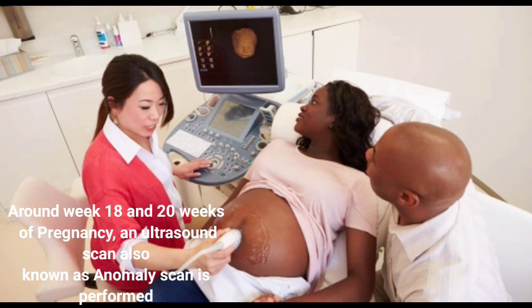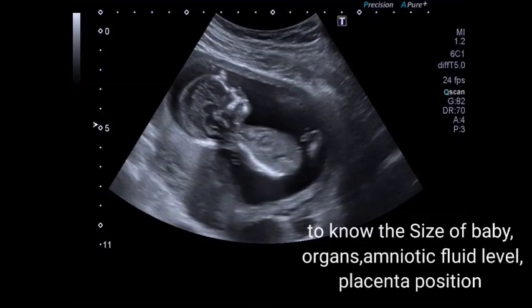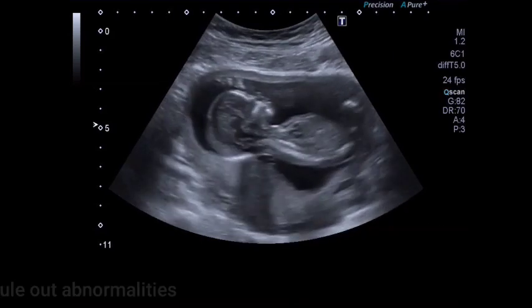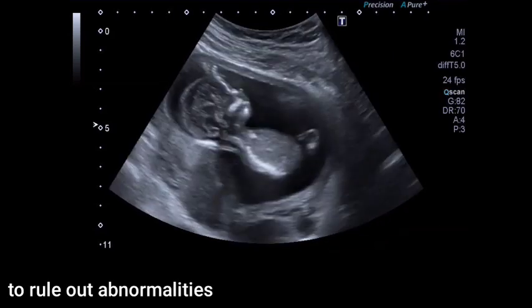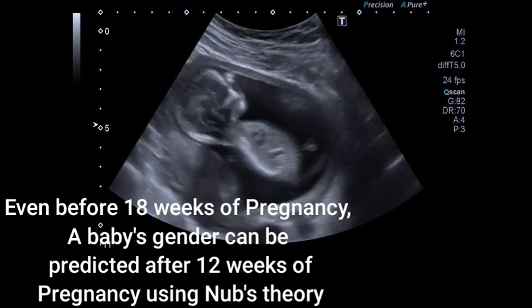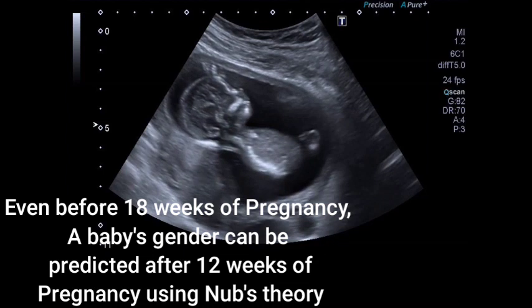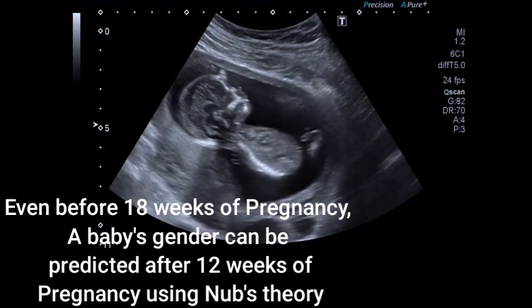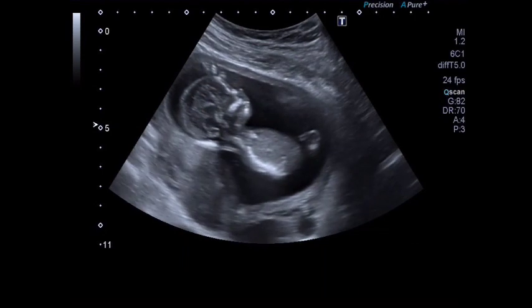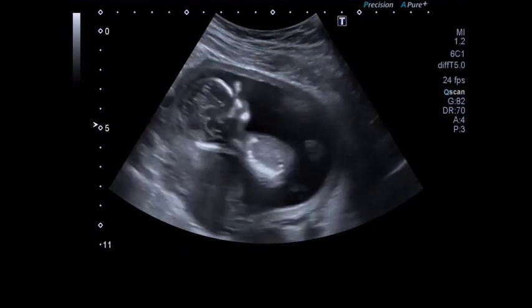Around 18 to 20 weeks of pregnancy, an ultrasound scan — also known as an anomaly scan — is performed to assess the size of the baby, organs, nuchal fold level, placenta position, and to rule out abnormalities. But even before 18 weeks, a baby's gender can still be predicted after 12 weeks using Nub Theory. Predicting the sex before the 18-week ultrasound is a 50/50 game at best.